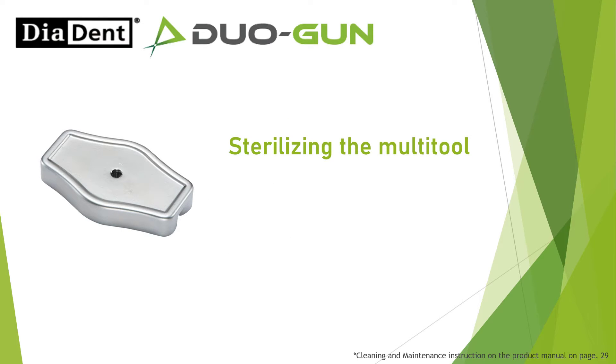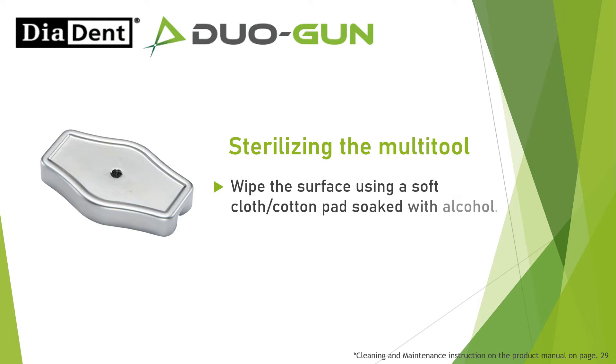Sterilizing the multi-tool: Wipe the surface using a soft cloth or cotton pad soaked with alcohol.